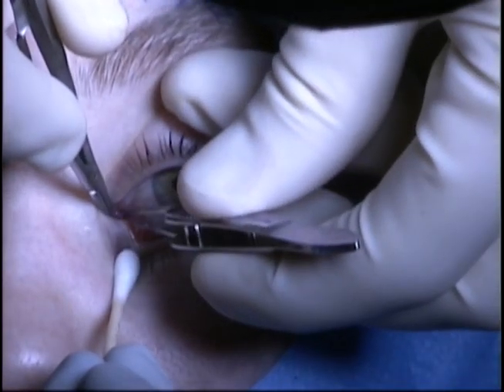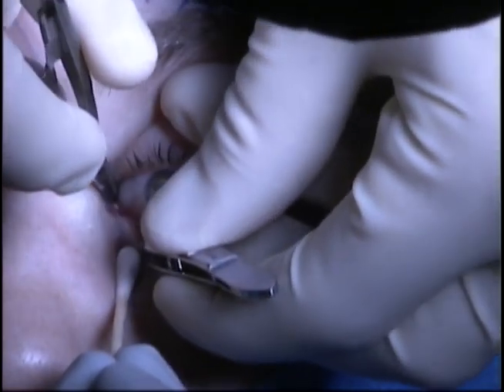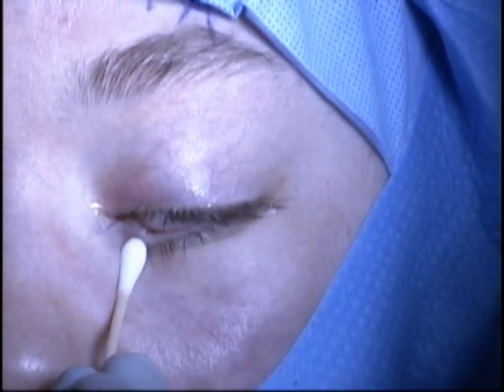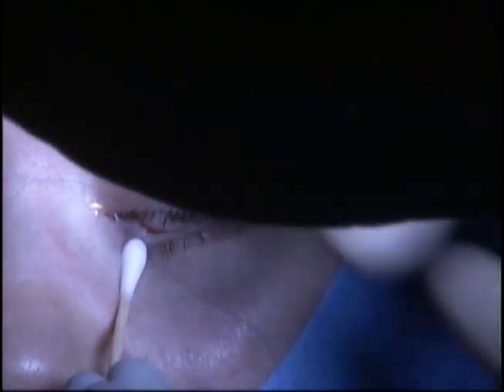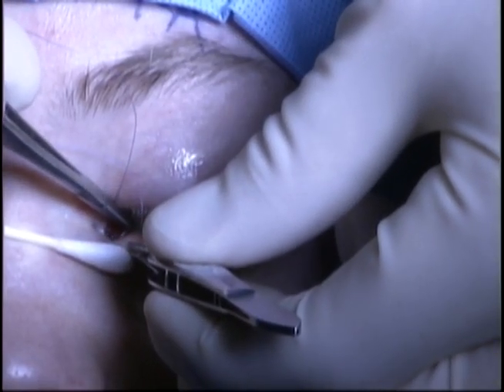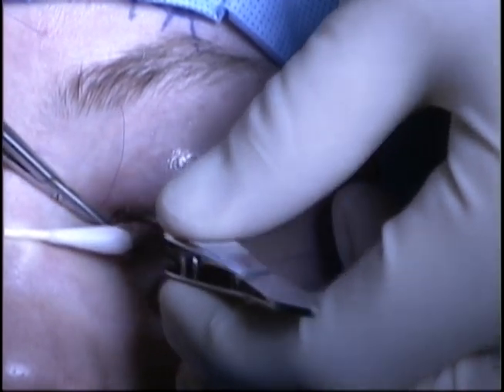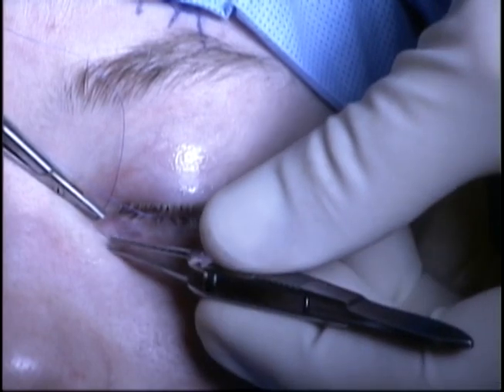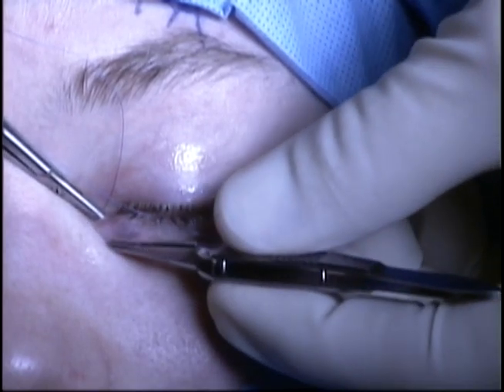The tube will be fixated for the early postoperative period with a 6-0 vicryl suture. The suture is placed as a noose around the tube and tied. The suture is double-armed and each arm is placed transcutaneous through the medial lower lid.